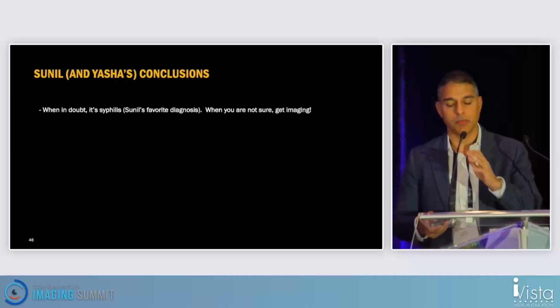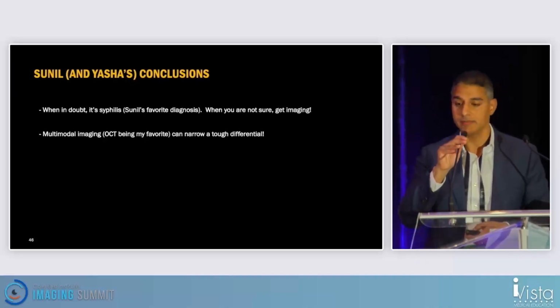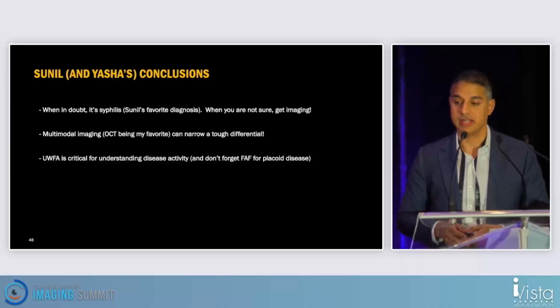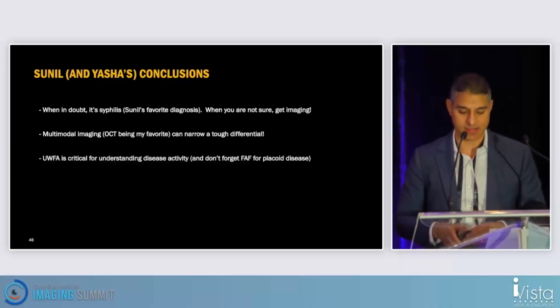So what I've learned from Sunil, when in doubt, it's syphilis. When you're not sure, get imaging. Multimodal imaging can narrow a tough differential, and ultra-wide field FA is critical for understanding disease activity. And don't forget autofluorescence when you're considering placoid disease. Thank you.